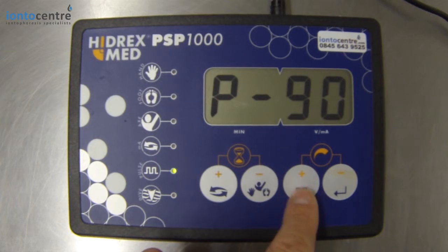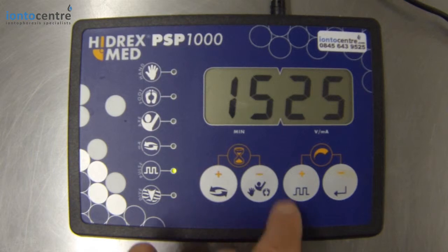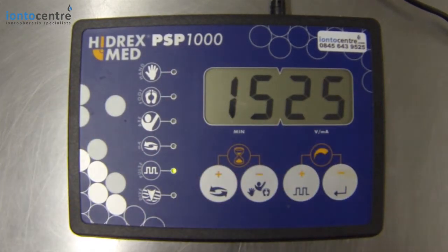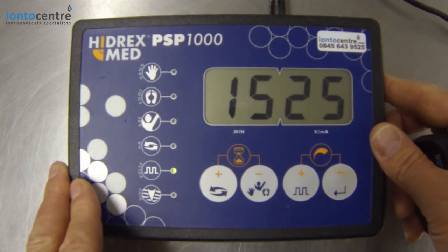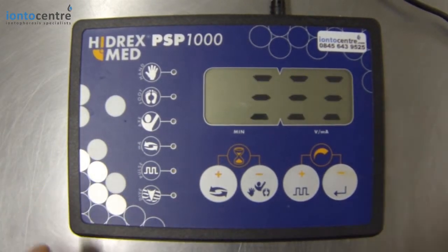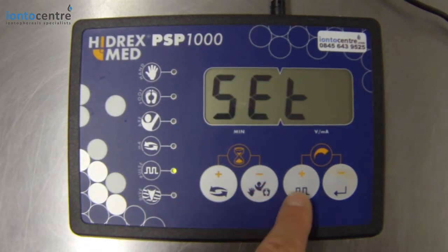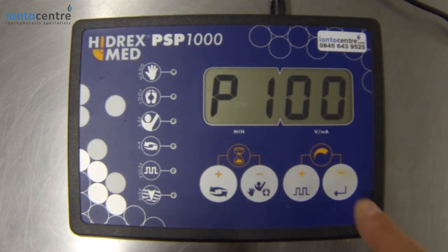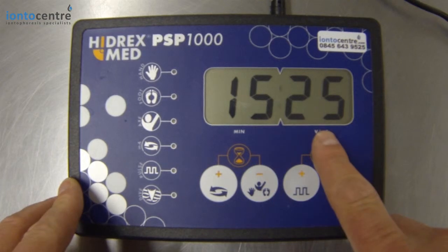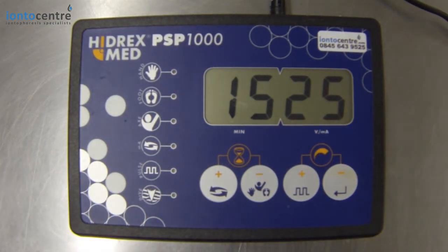P90 is the setting we recommend. Click enter and in you go. So you're in pulse current, you've got 15 minutes on the timer and 25 on the power. If you want to go into direct current to treat the feet, for example, again wait for the word 'set' to appear, press your pulse icon, go P90, enter it, and you're back to your time and back to your power — but this time the LED is off and you're in direct current.